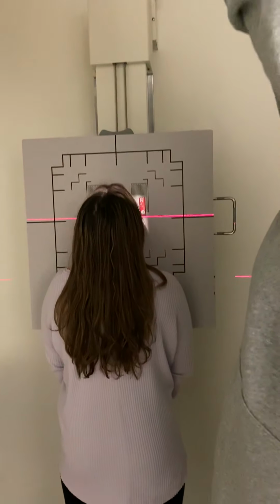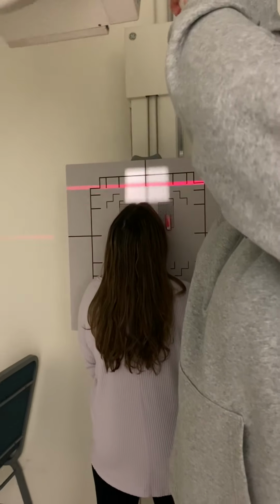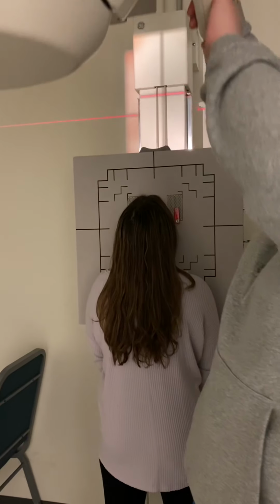And we're only going to have a 15-degree angle. Actually, it's going to be perpendicular. I'm sorry, I lied.